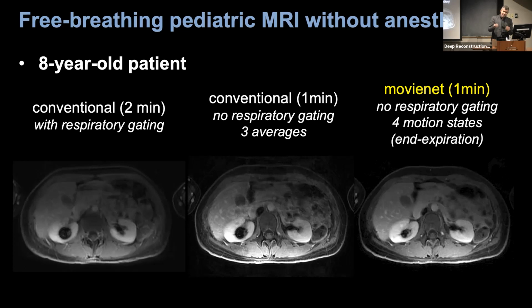So we can also apply it to younger kids. And if we can reduce acquisition time to just a few minutes, we can also reduce anesthesia depth. And this is going to help a lot in these pediatric examinations.